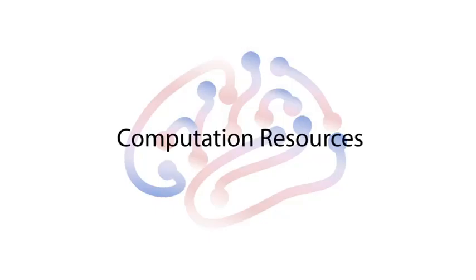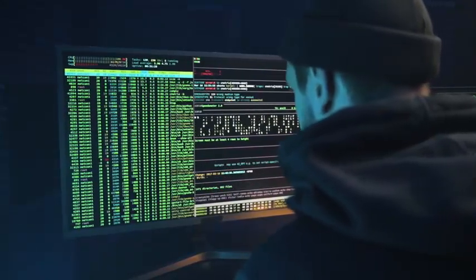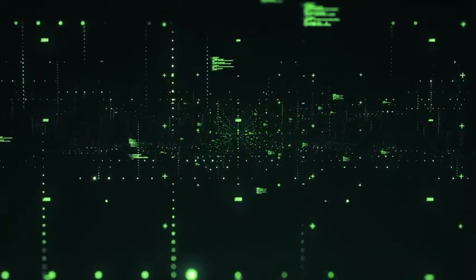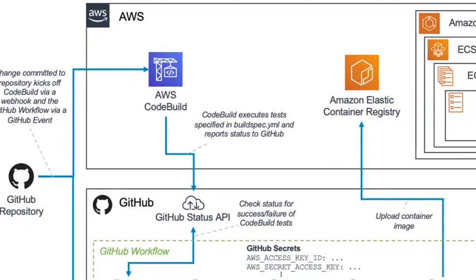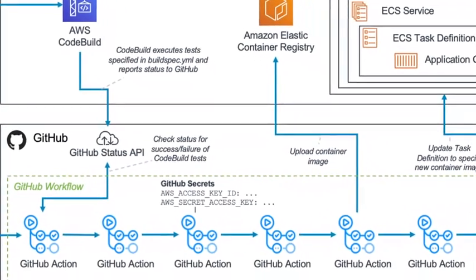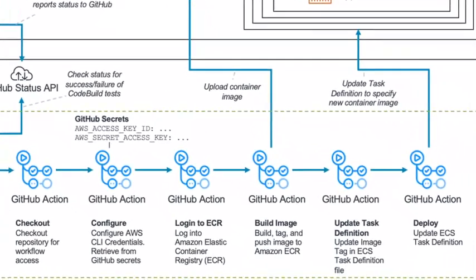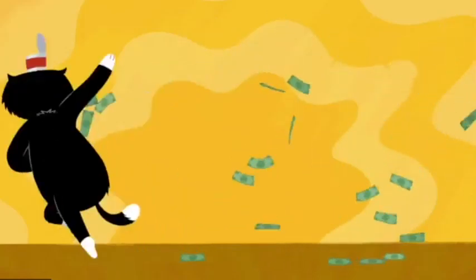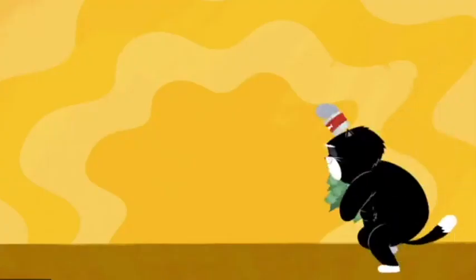Second, the computing resource available on cloud computing is much cheaper and more powerful than a regular laptop or desktop. DSI Studio Cloud uses computing resources offered by GitHub Action. GitHub Action offers 20 concurrent jobs with 2 CPU cores each. That is equivalent to a 40-core CPU workstation. The computation power is much stronger than most laptops or desktops. Most importantly, getting a GitHub account is free. For public repositories, you have unlimited and free computing resources.